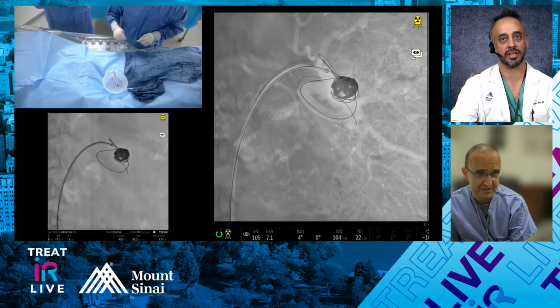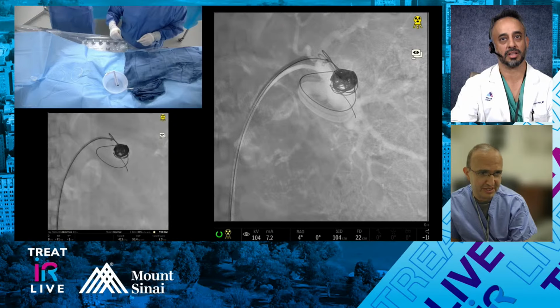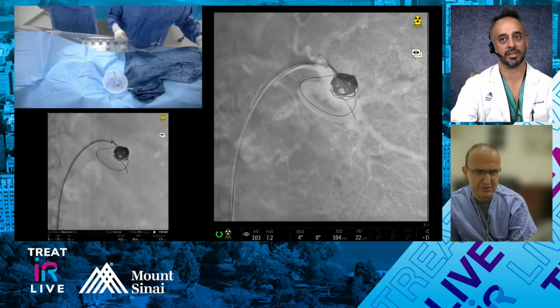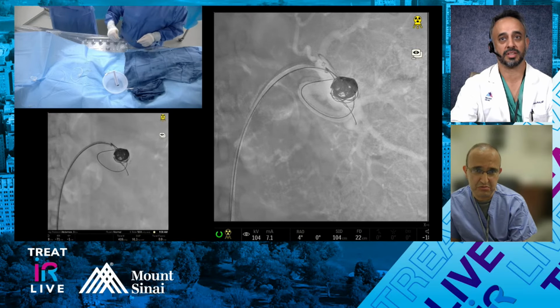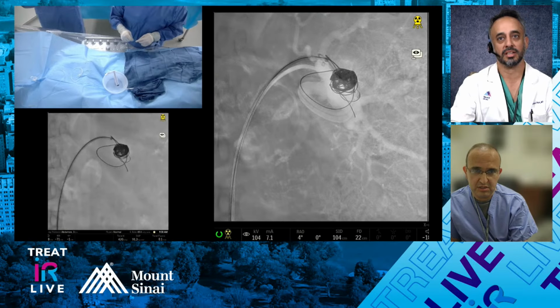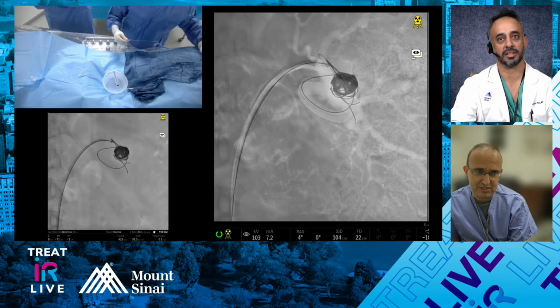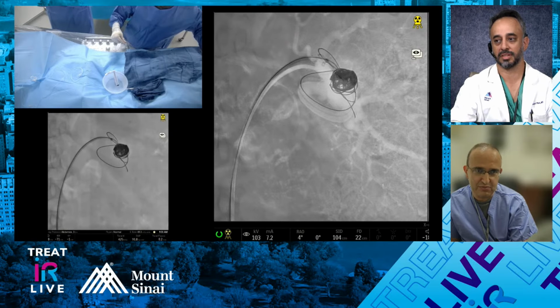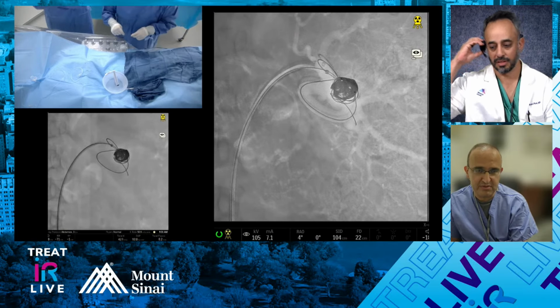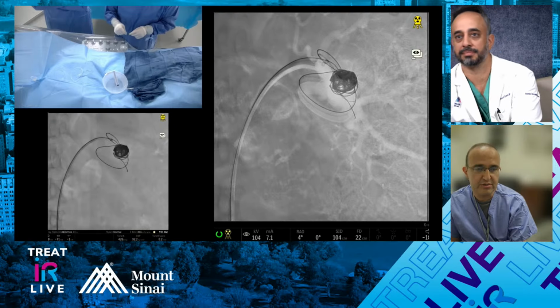Now that's obviously going to save money too in the long run, because I think the longest pushable is like 14, 16 centimeters, right? You guys have longer pushables? I only know the nesters, right? The micro nesters are 14. So this is basically three times the length of a micro nester. I know it's still more expensive than a pushable, but it definitely evens it out a little bit.